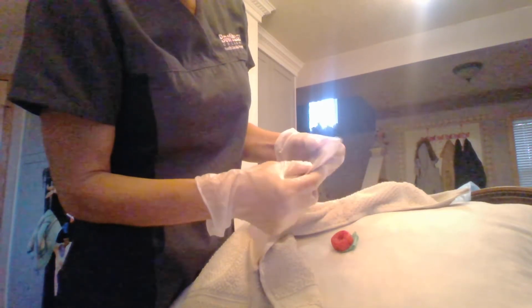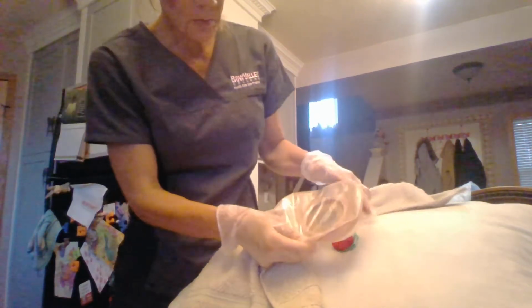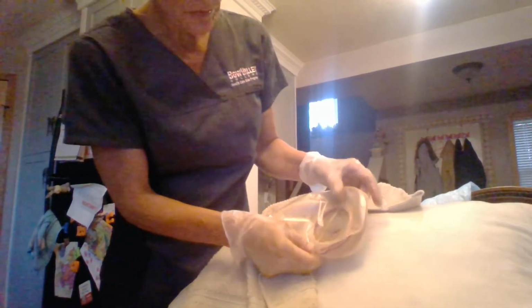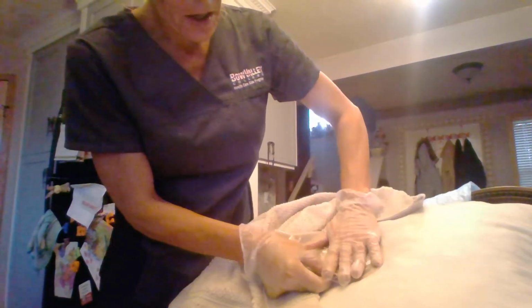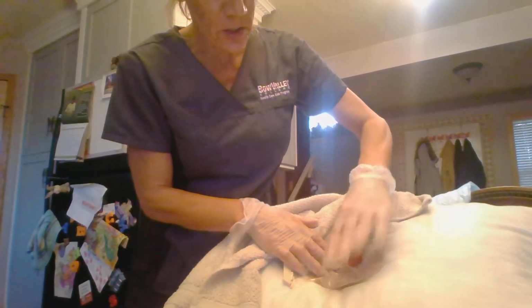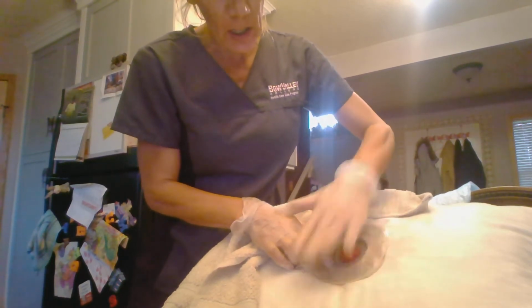And what I've seen, which I think makes more sense, is that once you peel the back of this off, and your barrier cream is on the back, and make sure you follow the instructions for your barrier cream, you would place this around the stoma and press it down. Now, the client could help you if they're able, or maybe this is the first, well, you wouldn't be doing it on a first-time client anyways, but he could help you.